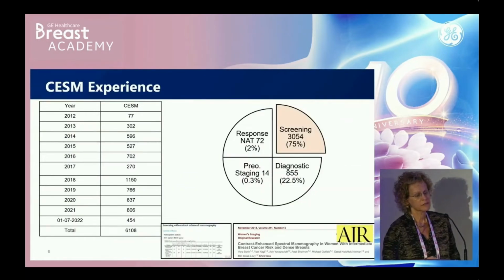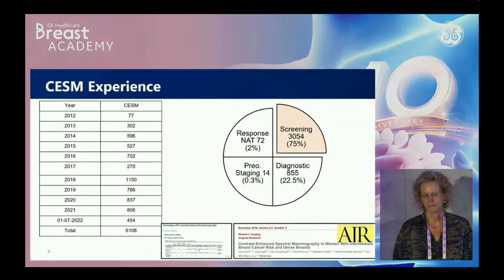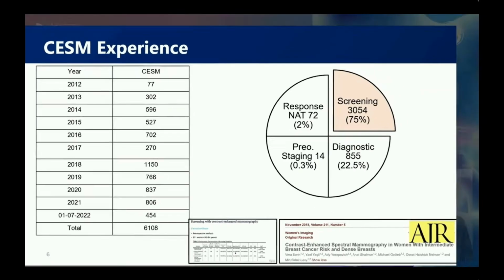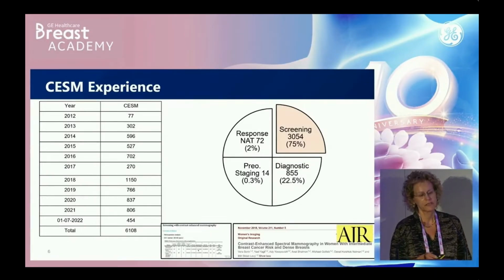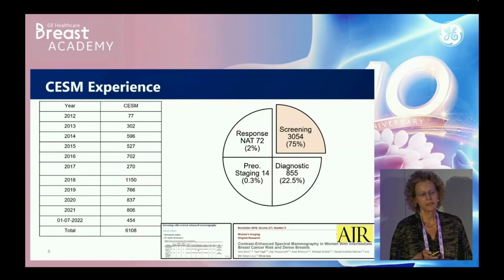Regarding our experience with contrast mammography, I think we're among the first users, using it since 2012, and you can see that the numbers are increasing. Most of our studies started with clinical diagnostic indications, such as evaluation of extent of disease and palpable lesions, but with gaining experience we started to use it as a screening examination. As you can see, most of our studies are now screening.